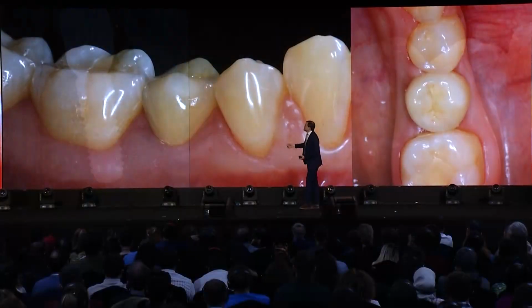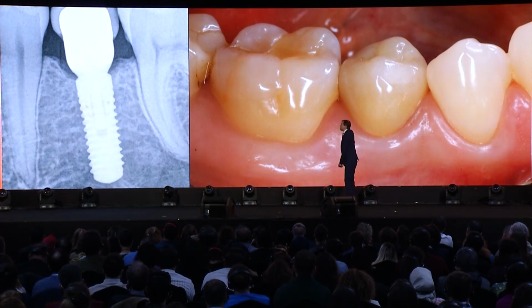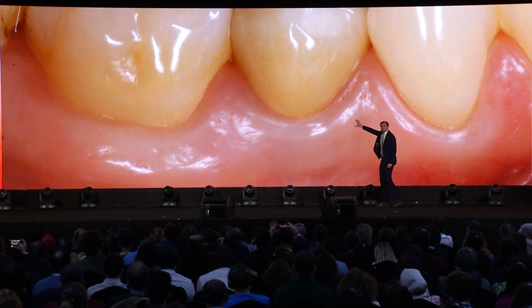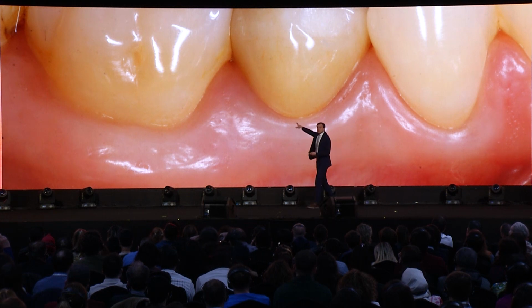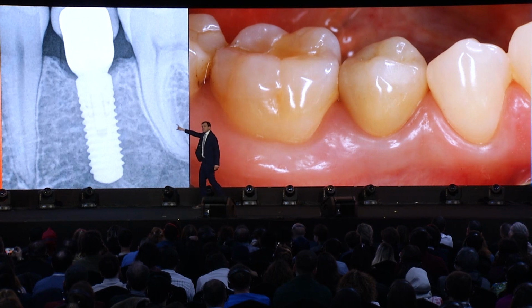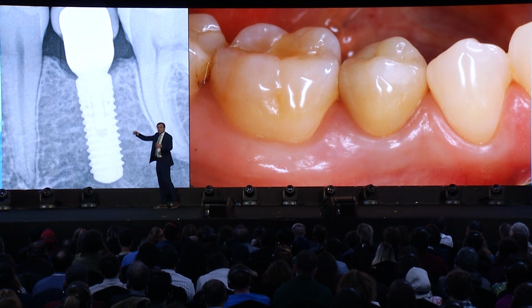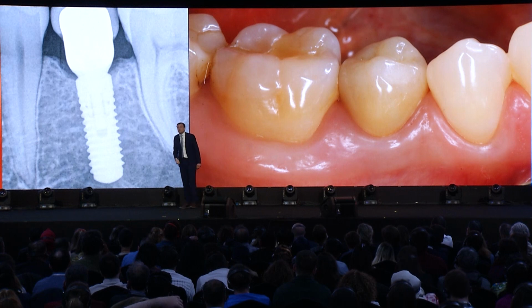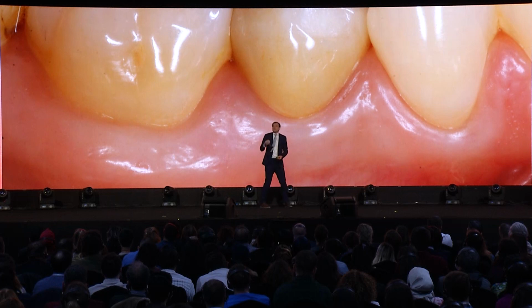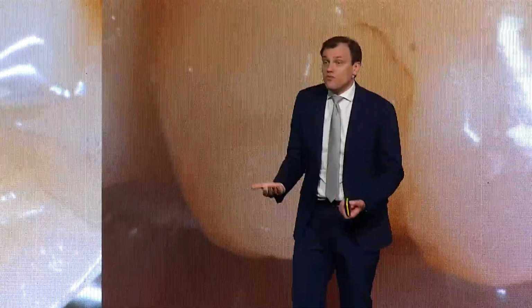Again, another example. This is this case after, I think, 10 or more years follow-up. Now take a look at those tissues. Now, this implant was never probed. I go back. Never. In 10 years, not a single probing, not a single subgingival cleaning with superfloss, only interproximal spaces with interdental brush. So apparently, this is different.